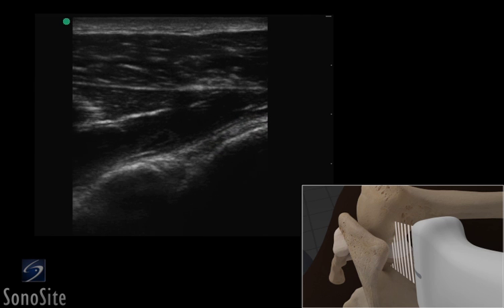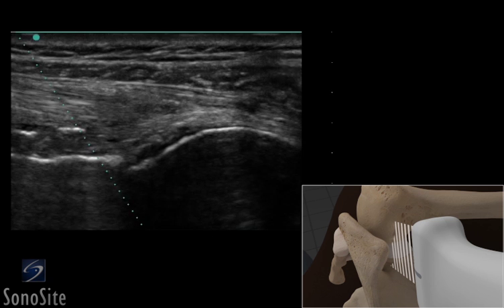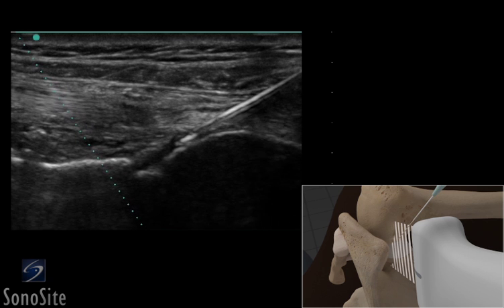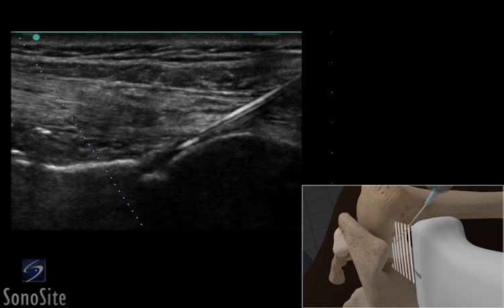The transducer is adjusted so it is centered over the glenohumeral joint line. The needle is inserted in the skin just proximal to the transducer on the opposite side of the orientation marker, and is slowly advanced to lie in-plane to the transducer beam, appearing as a bright hyperechoic linear structure.